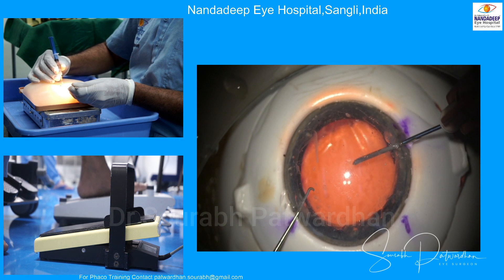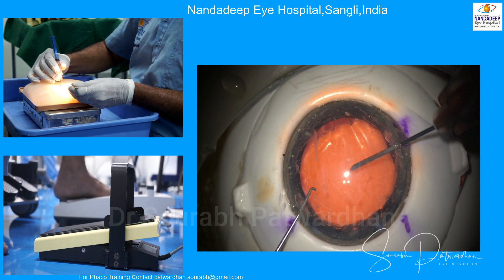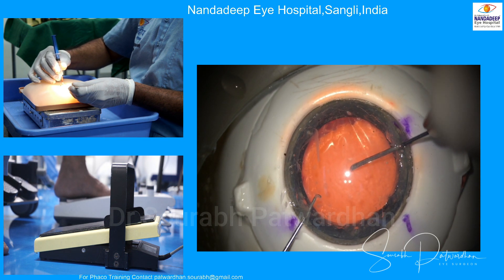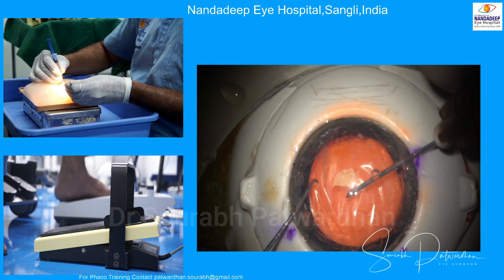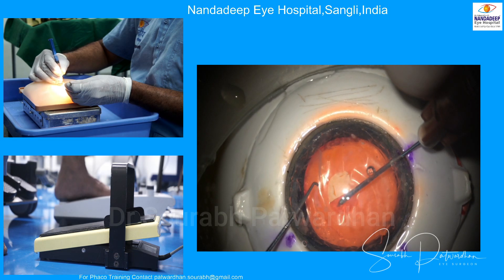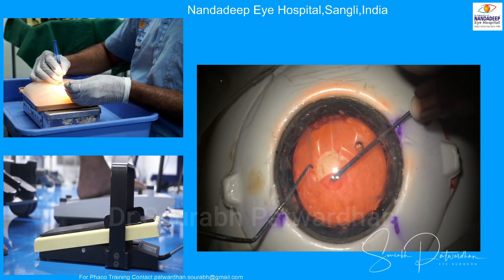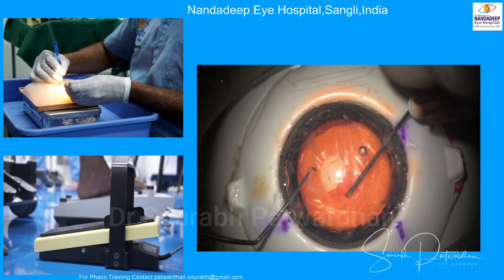Here, the trainer can guide you on how to keep the flap flat on the anterior surface of the lens, which is very important while doing capsular rhexis, and also how to stabilize the eye during surgery. You can use either a Sinskey dialer or limbal forceps to hold the eye during movements. You also have to use your foot switch to focus continuously and center the eye.